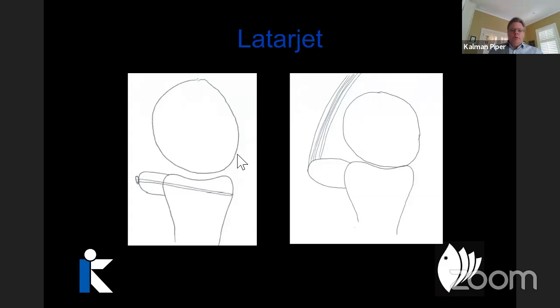Well, there are two real effects that I try to explain to my patients as to why I'm changing their anatomy. The first is fairly easy to explain. The piece of bone on the front of the socket increases the size of the socket and therefore helps prevent the shoulder coming out. But more importantly, this stops the Hill-Sachs fracture engaging. So as the patient rotates around, the Hill-Sachs fracture cannot engage on the front lip of the glenoid if there is a bone blocking that.